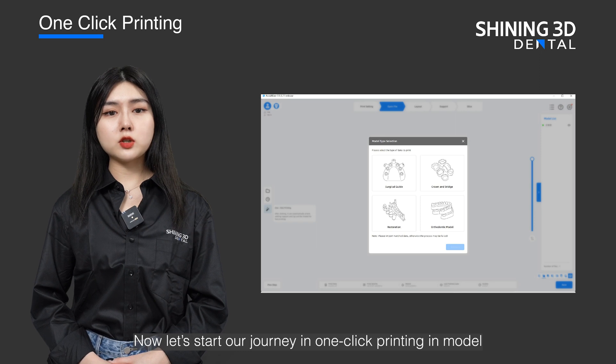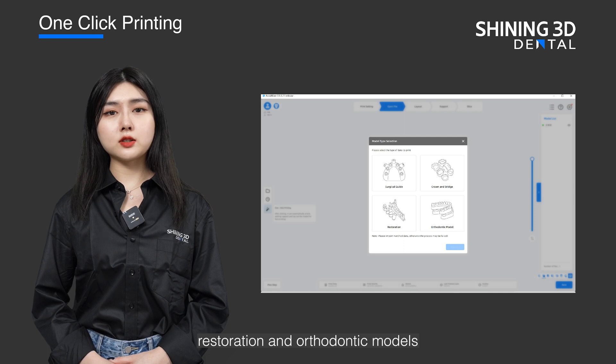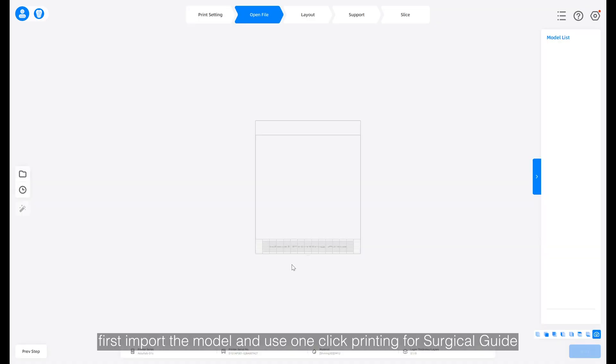Now let's start our journey in one-click printing for model, crown and bridge restoration, and orthodontic models. We are going to start with surgical guide. First, import the model and use one-click printing for surgical guide.